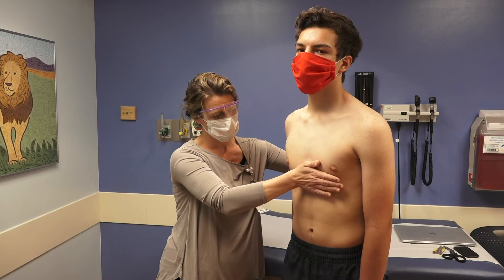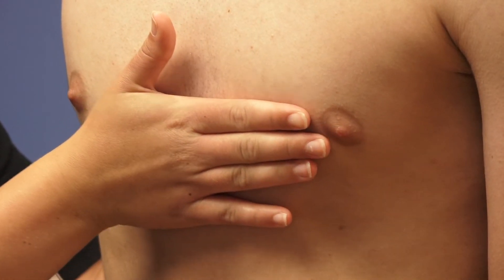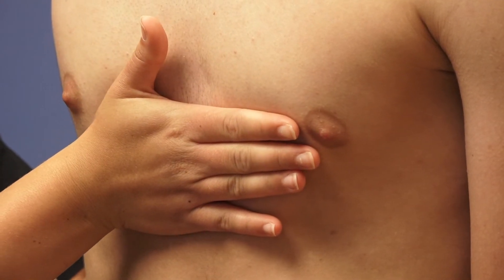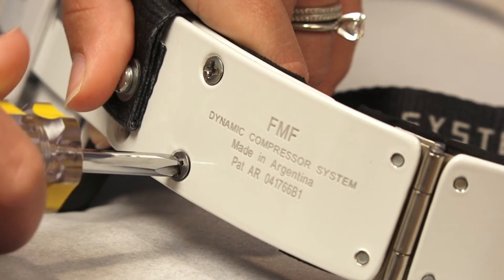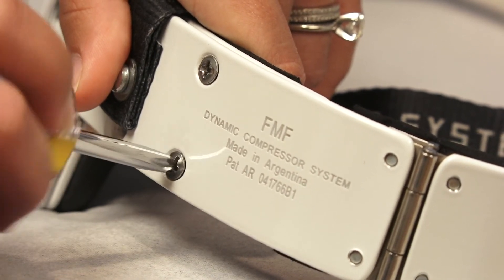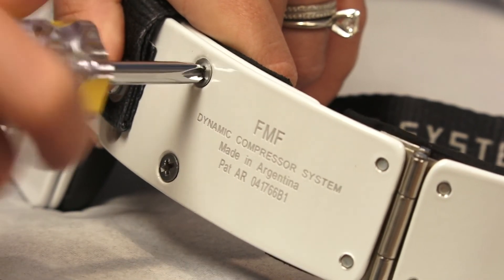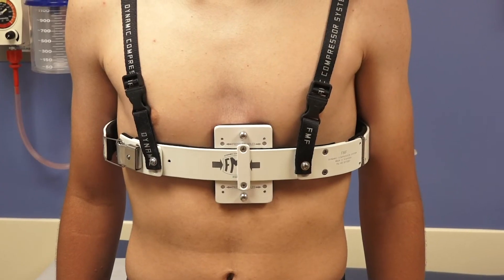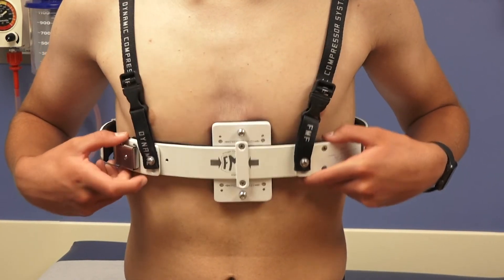We will also want to see how easily your chest can be pushed in by having your parent or guardian push on the area that sticks out until it is in neutral position. Now we are ready to make the brace adjustments. The nurse and provider will instruct you on which screws and pieces to adjust. Once the adjustments are made, we will ensure that the brace fits well and is providing good pressure by having the patient move the brace up and down again.